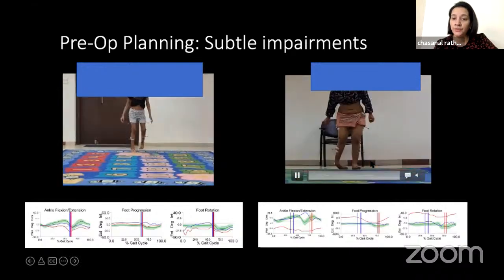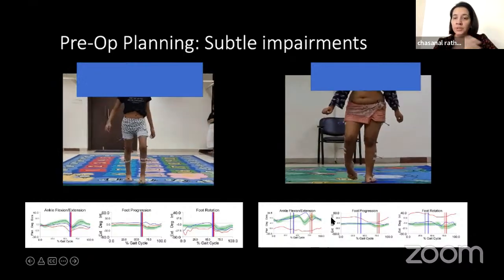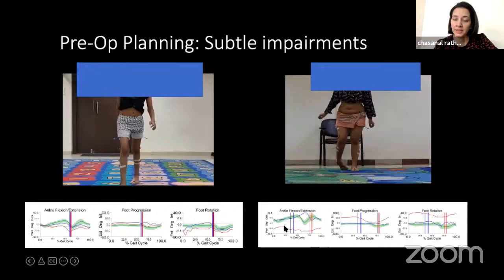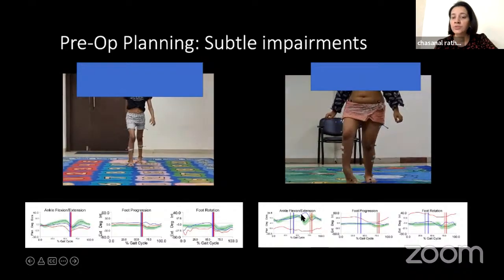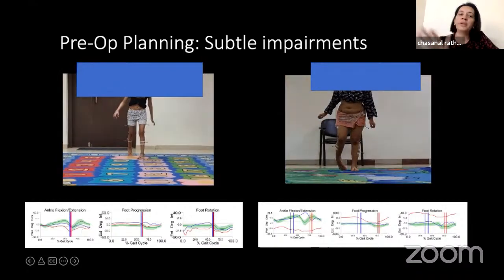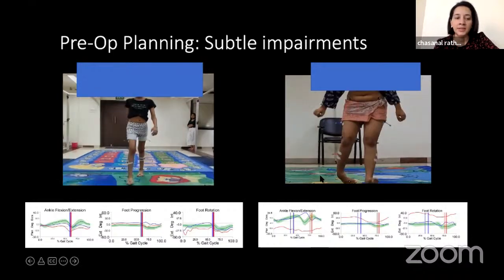Similarly, this child, if you see, there's a severe equinovarus. Now she is a heavy child compared to this, although the age groups are similar. But the equinus, look at the amount of the equinus, the red line here. It's so much away from the green. So the deviation is so much. Understand that here the deviation is so less, but there are demanding parents who want a perfect gait pattern, and we should act quickly before this sets in and becomes worse.